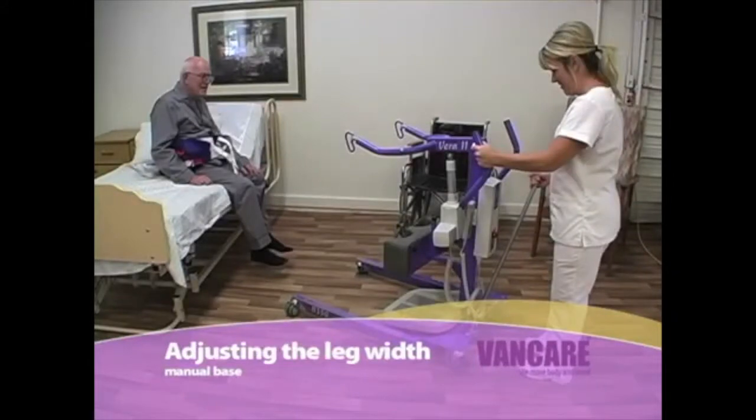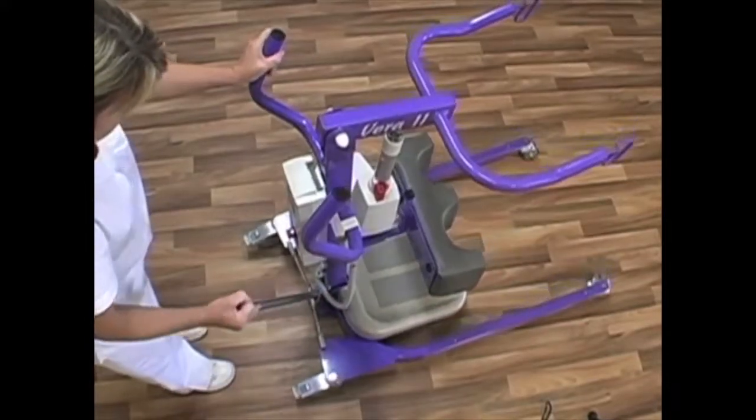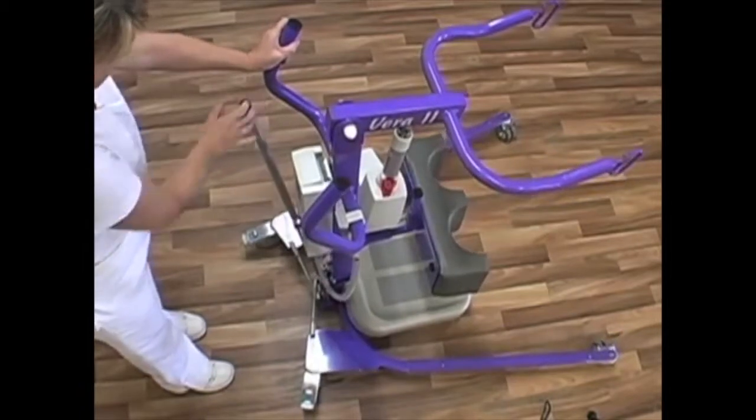Adjusting the base width — manual base. The base of the Vera 2 should be open to its widest position for all transfers. The base may be narrowed to go through doorways, but must be opened after the lift has cleared the door. To adjust the width of the base, stand behind the lift, grasp the handle on the shift bar and move the shift bar as shown.